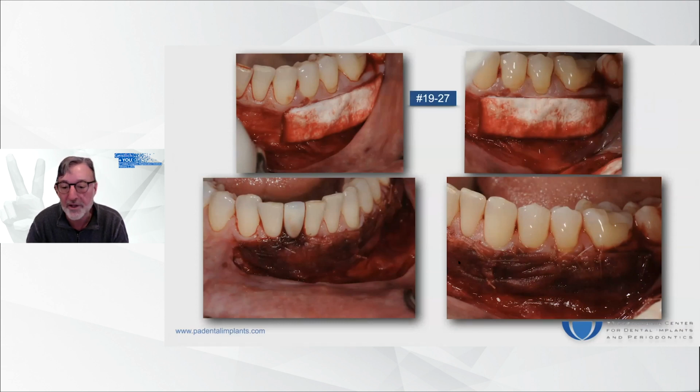And then in the lower anteriors, we took a second piece of it. Actually, it's one piece cut in half. You see, I've connected the two. This is a 6-0 plain gut. What I did here, and this is important, prior to placing this material, we're using 1 to 50,000 locally with epinephrine. We're also using 1 to 50,000 in a gauze with my assistant pressing in this area, just light pressure. I got up to check a hygiene patient, so I was probably gone about 5 minutes, so that when I place the material, this is what you want it to look like. If it looks like this when you place it, this will be very difficult to use. So this is what you want. You want good hemostasis so that at the end, with taking pictures and everything else, it's going to look more like this.